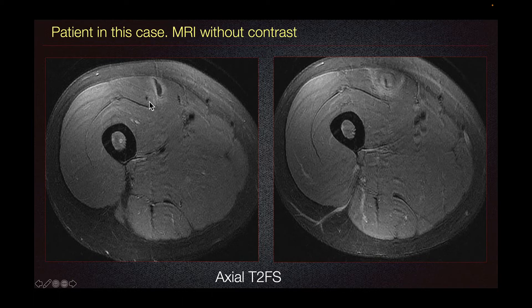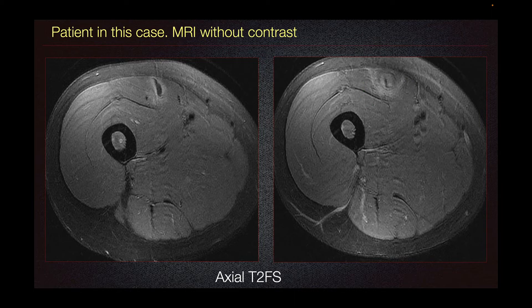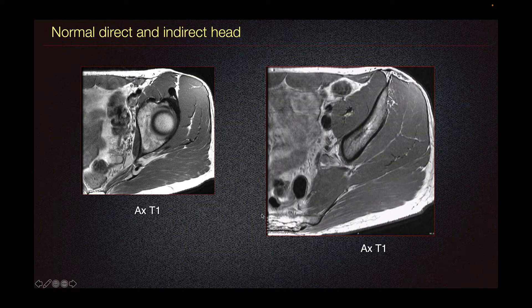Here on our axial T2 fat sat imaging, we can see some edema predominantly involving the inner muscle belly of the rectus femoris. These findings are consistent with likely subacute low-grade strain of the rectus femoris.